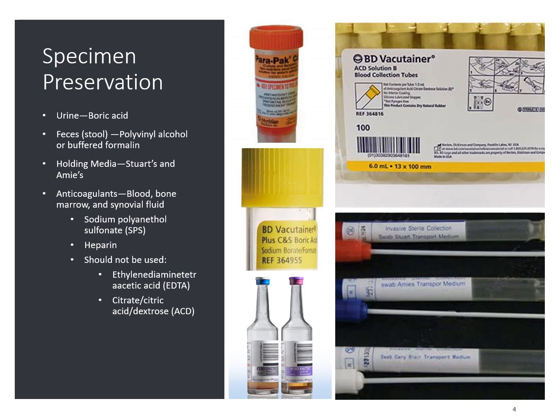They have something in them to either prevent the specimen from being exposed to air, or to provide some sort of extra nutrients, or to prevent the organisms themselves from drying out. With your blood cultures, you see those two bottles at the bottom that actually look like bottles. Blood cultures typically have some sort of SPS within the bottles that helps to preserve those organisms, and to help enhance their growth once it is loaded onto the analyzer.